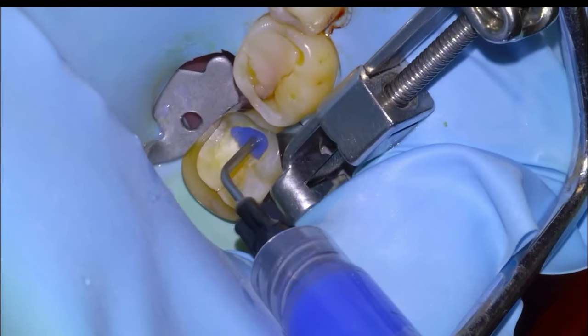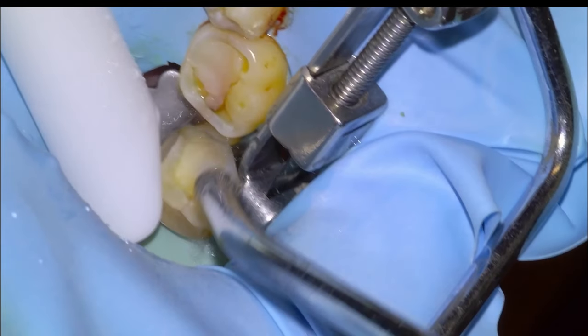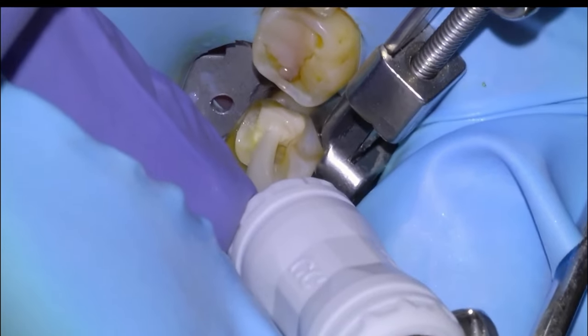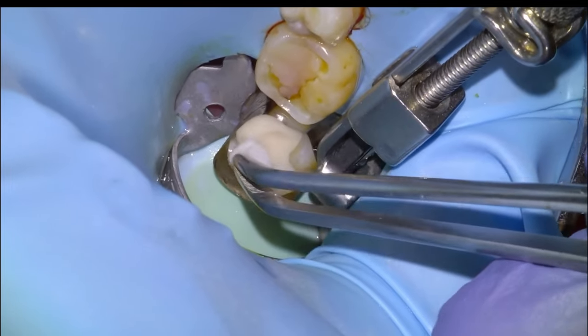I like to condition the surface of the tooth for my Equia Forte with a five-second phosphoric acid etch. The manufacturer says to use a 15-second polyacrylic acid scrub, but I find that the five-second phosphoric acid etch does well and I've seen literature that backs that up.